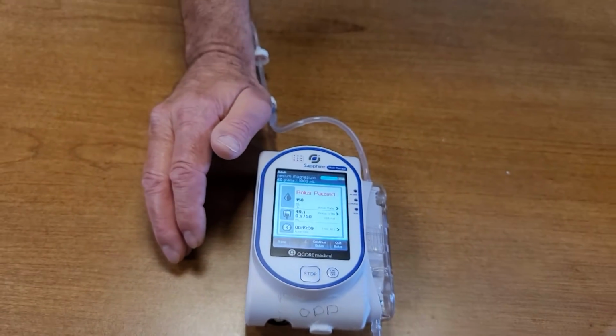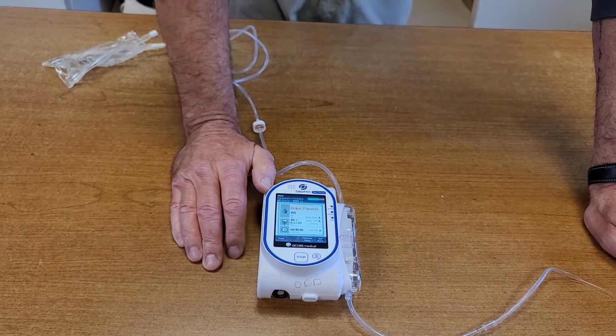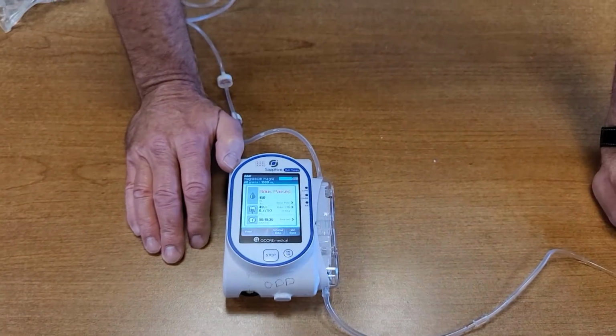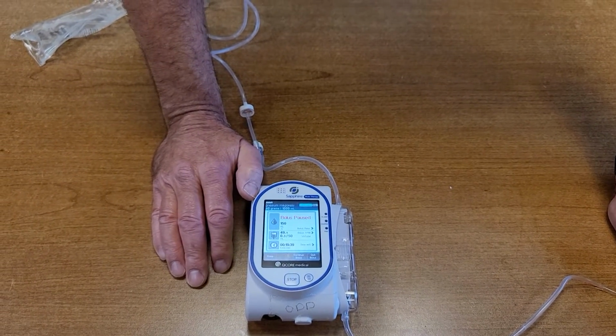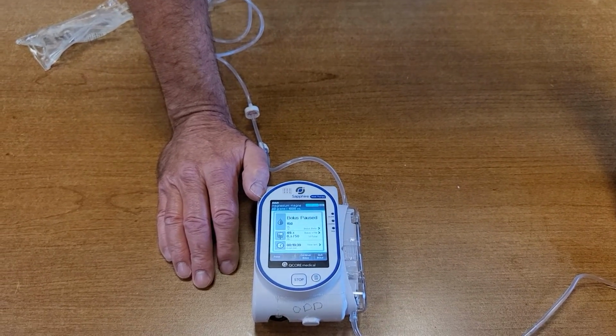We showed you in the adult mode. If you need to get from the adult mode to the pediatric mode, the easiest way to do it is probably just to turn the pump off and turn it back on, and it will ask you, do you want to continue adult or do you want to switch to peds? And then you can switch to peds at that time, which I think is what most people are doing.